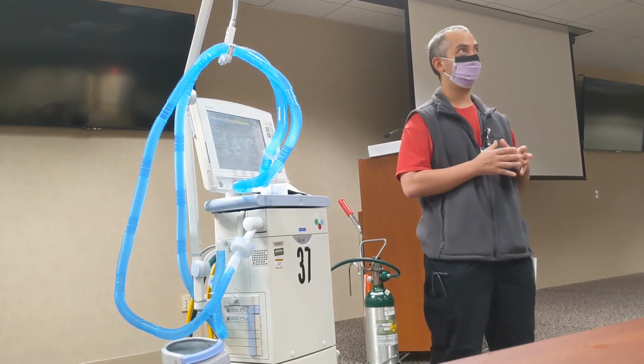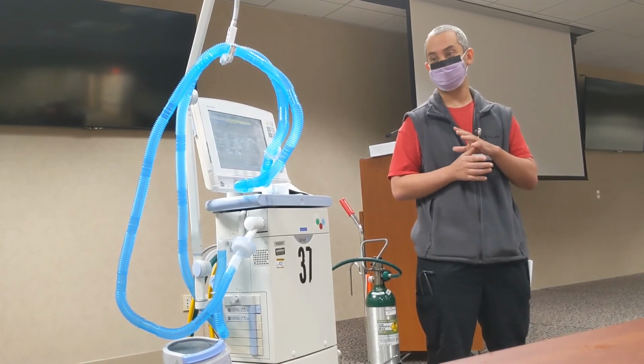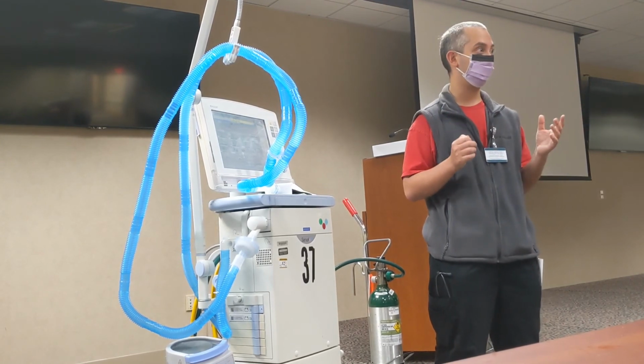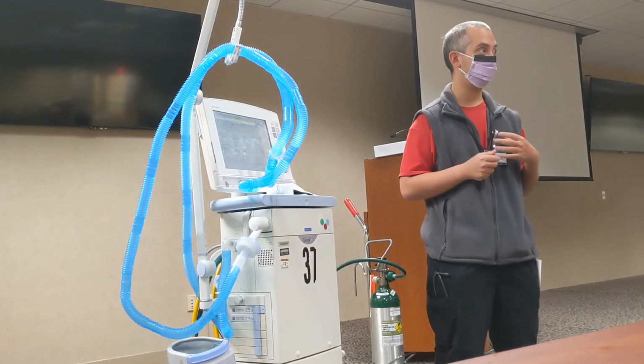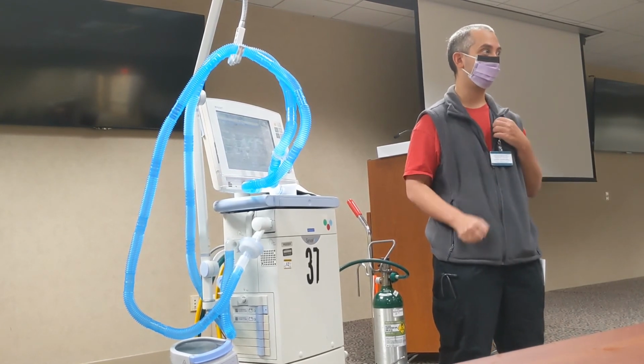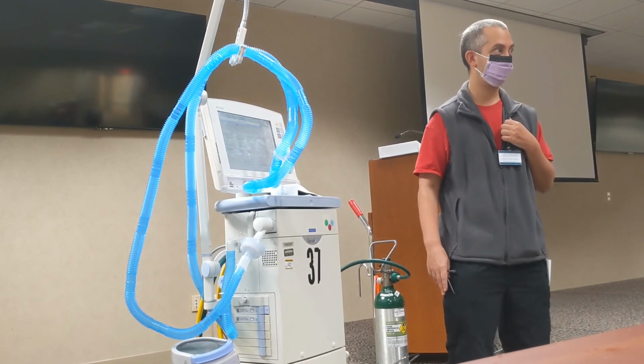But really, the benefit of it, you shouldn't see like this magical improvement within 5 to 10 minutes. Most of these people, it takes a long time for them to recruit up.